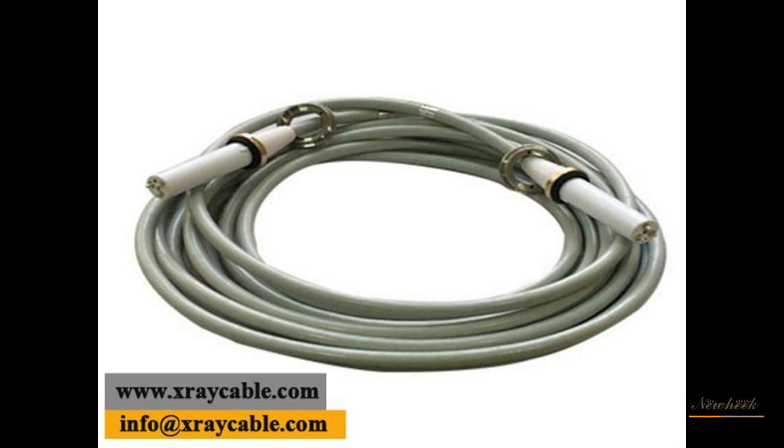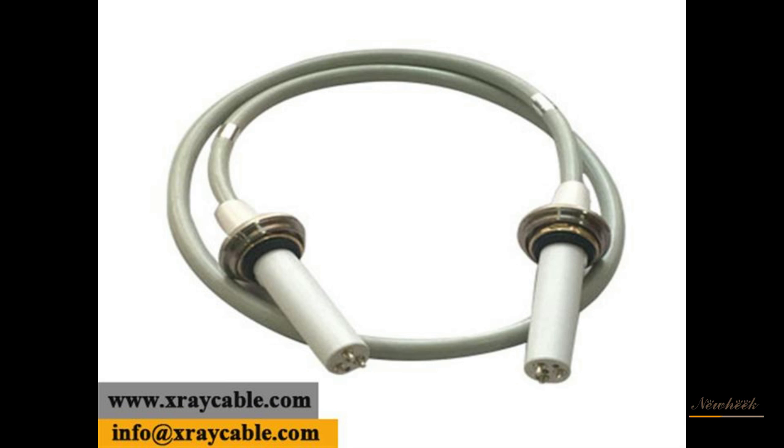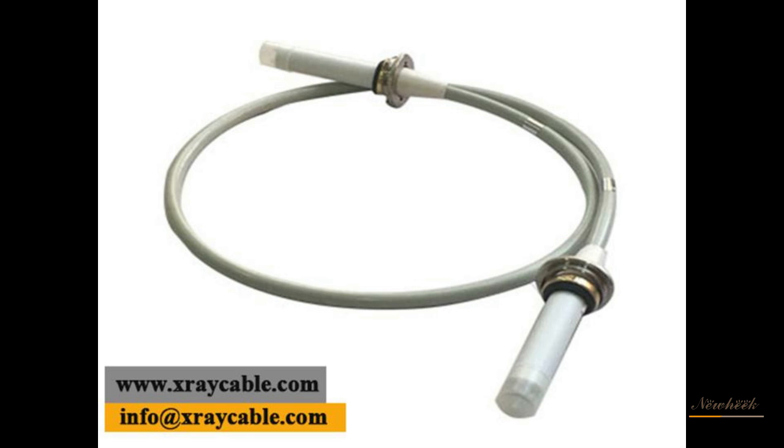The X-ray machine high-voltage cable is an important part of the high-voltage system. It is used to connect the high-voltage generator with the bulb, mainly to transmit the positive and negative high voltage of the X-ray tube and the heating voltage of the filament.